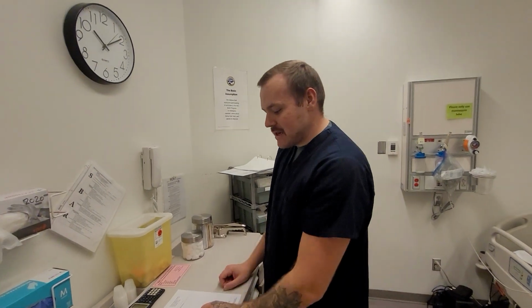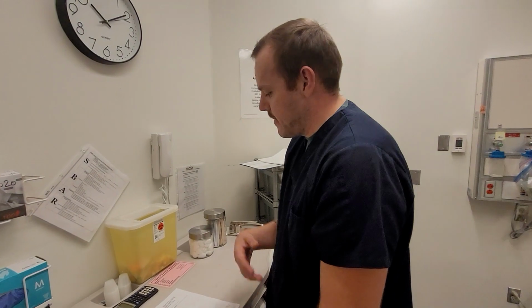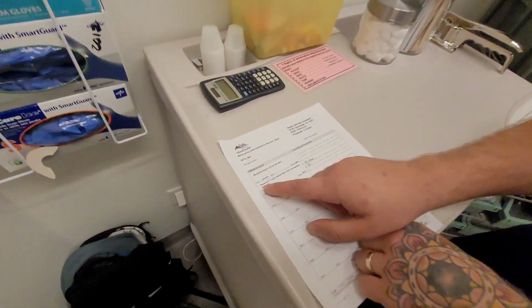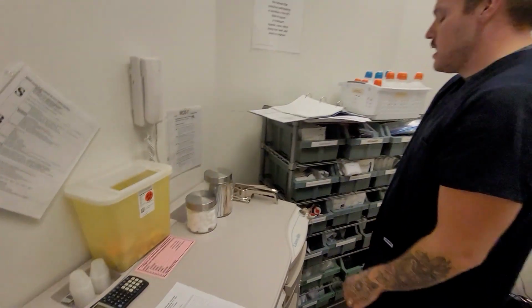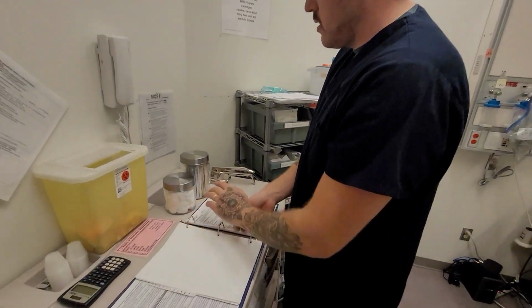We're going to be giving naloxone today through a direct IV. It's for demonstration purposes, so I'll be basically walking through everything. First things first, we're going to check our MAR. We've got an order for naloxone 0.1 milligrams IV stat for respirations less than 8. We're going to go to our IV monographs and check over naloxone.